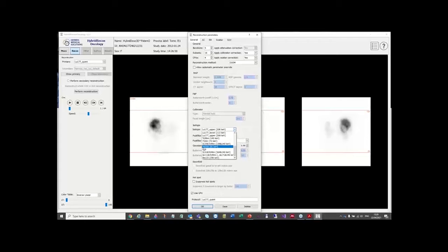We have here some new exciting isotopes, so holmium-166, which Jill touched on in her presentation. There's lots of interest in this on the European side, especially. Basically, as a replacement for yttrium-90 microspheres, holmium-166 is coming into that field. Got barium-133 as well here, quite recent, and various dual isotope pairs as well, some of which have that down scatter correction that David was talking about yesterday.